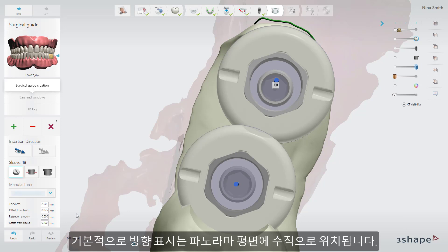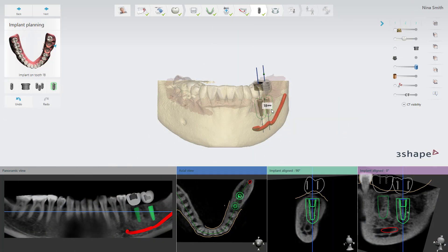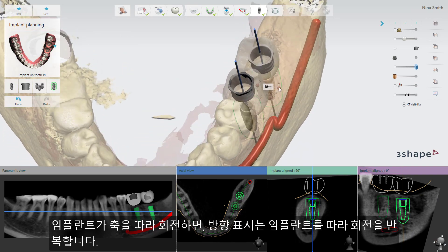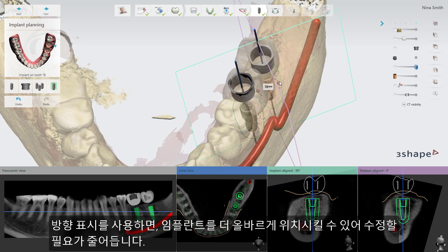By default, the orientation mark will be positioned perpendicular to the panoramic plane. When the implant is being rotated around its axis, the orientation marks will repeat the rotation of the implant. By using orientation marks, you can more easily position the implant correctly and reduce the need for corrections.